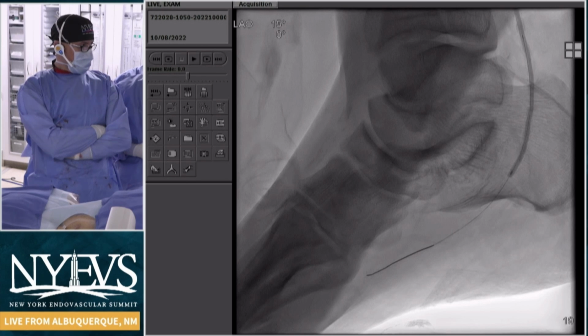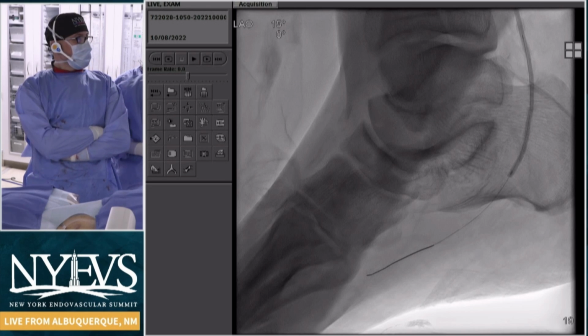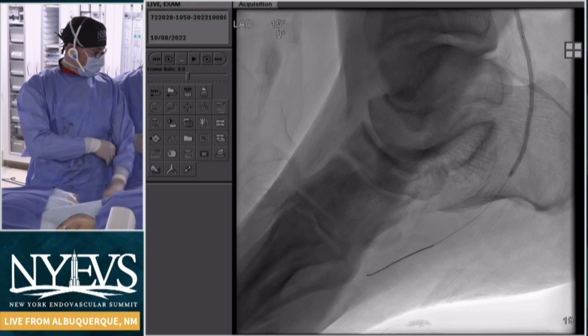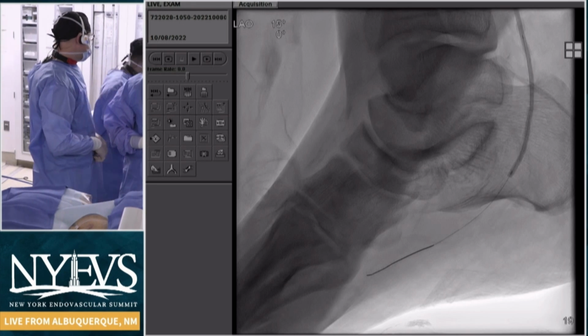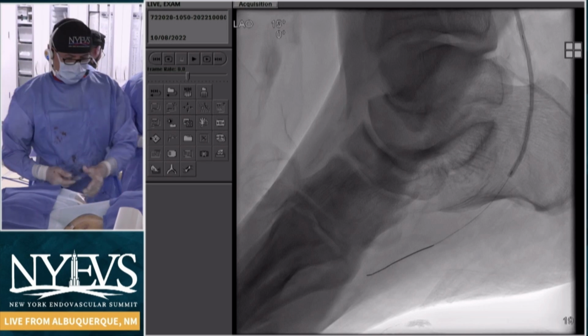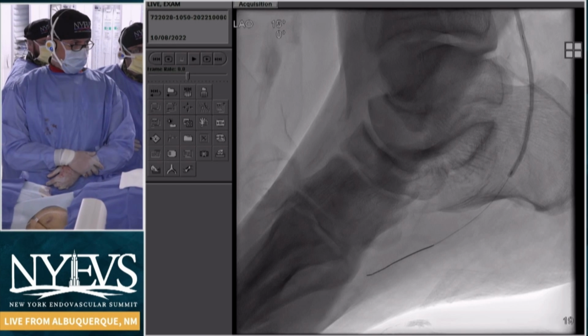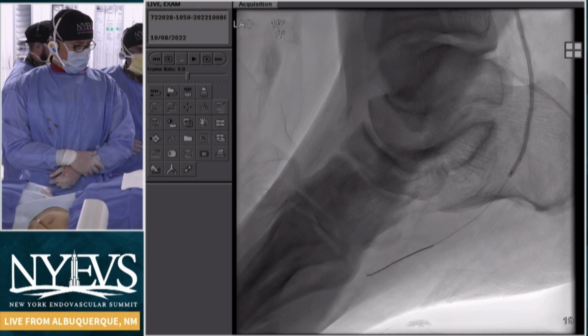Yeah, I think this is a very challenging area. What is important, in my opinion, and what we do in our practice, is the evaluation with the clinicians, evaluating the foot in the foot clinic, because they give us information on what to do and how aggressive we must be, because sometimes there is no other option, so we have to try everything. But in other conditions, maybe you work for an hour and immediately after everything is closed again, or you have a more severe condition. It's difficult to find the good balance, but definitely you need a little bit more experience if you work here compared to above the knee.